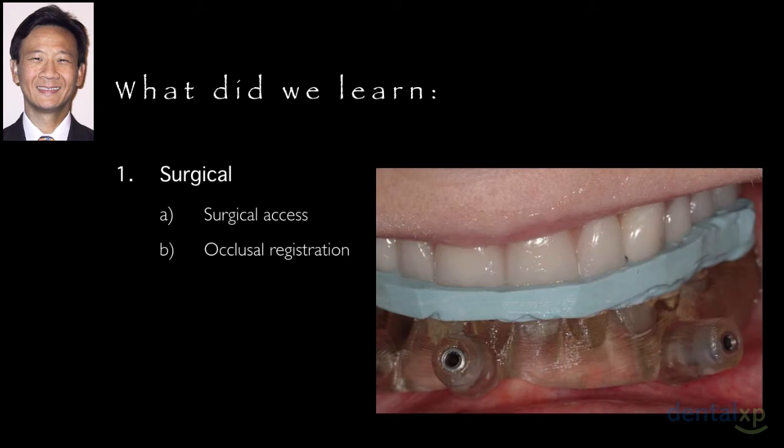The occlusal registration is also crucial because remember, the most important part of planning these treatments is the position the patient is scanned in, that centric relation record, and the use of the radiographic template has to be duplicated on the patient with the surgical template. Again, the position of the radiographic template and the position of the surgical template must coincide to have greater accuracy, because the position that we plan the implants in the software is the position the radiographic template was placed, and therefore the transfer of the surgical template position is crucial. That is why a surgical index must be fabricated for every patient so that we have that transfer of the position of the surgical template.